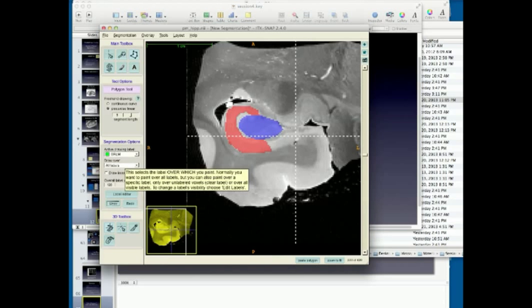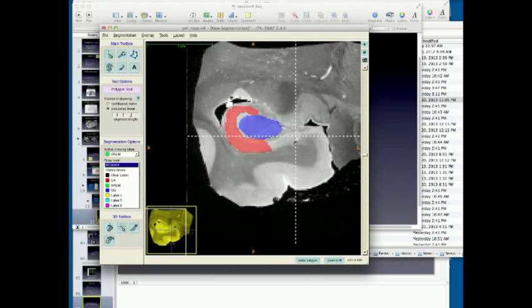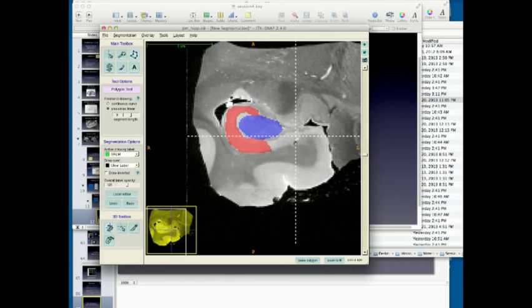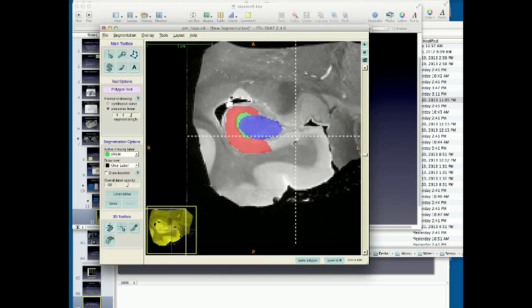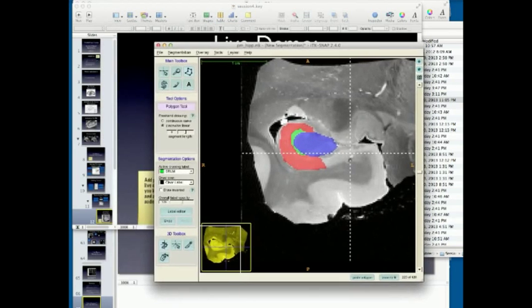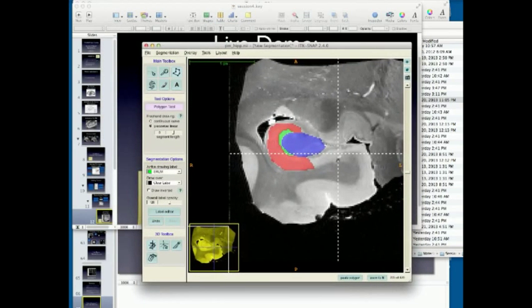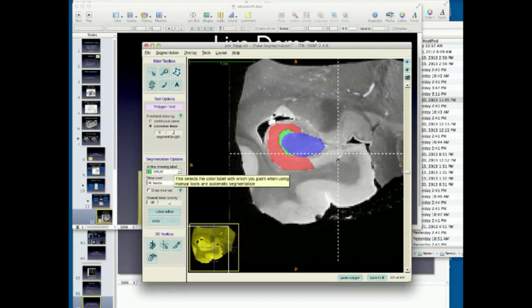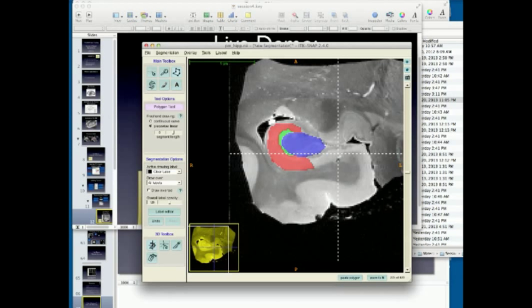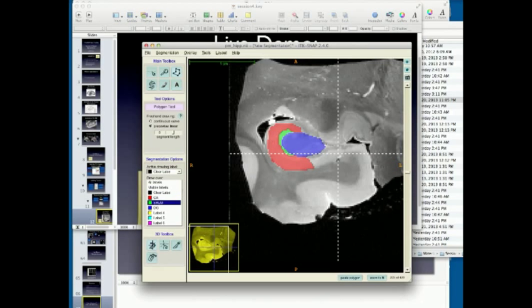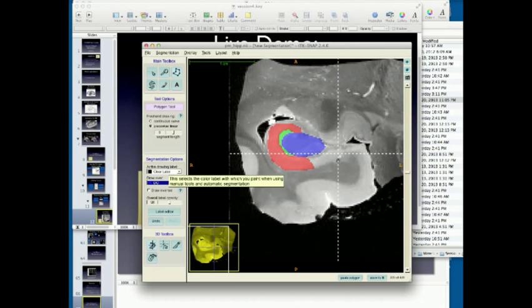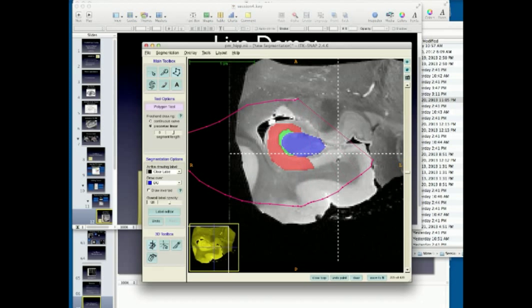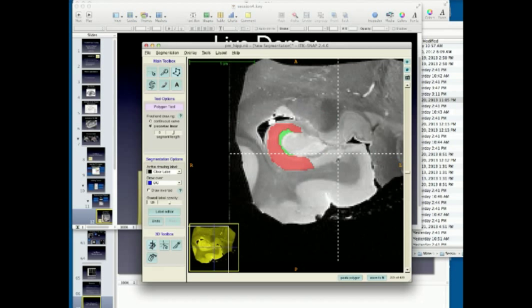So if I want to get this, you know, I have to draw this kind of careful area, and it's really difficult. And when I accept it, it overwrites my previous segmentation. So let's just undo that. Now if I select the draw over area instead to be clear label, so now SRLM will only be applied to voxels that don't have any other labels on top of them. So I can do this much faster. Just draw this wide area, and it will only apply it to these clear voxels. Is that clear to everyone? And another point that's not always obvious, to erase labels, you select your active drawing label to be clear label, and you basically draw what you want to remove. So let's say I'm not happy with my dentate segmentation. I could select dentate, and now I'll only draw clear label over dentate. So even if I select the whole image, it'll only erase that area. Okay?